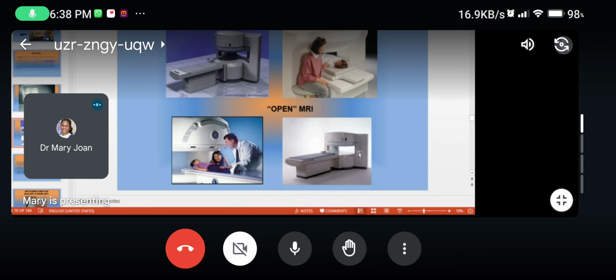Yeah, the B naught will be the same. It will be along this direction or this direction. So however we place the patient, head first or foot first, whatever orientation we have to do, the direction will be like this. Then accordingly X, Y and Z gradient coils will be there. So the B naught direction will be like this.